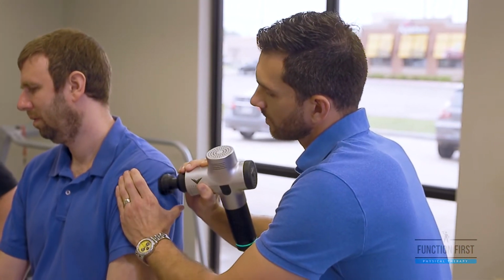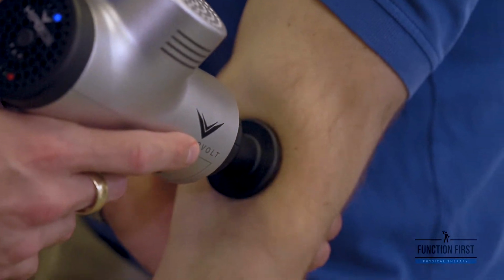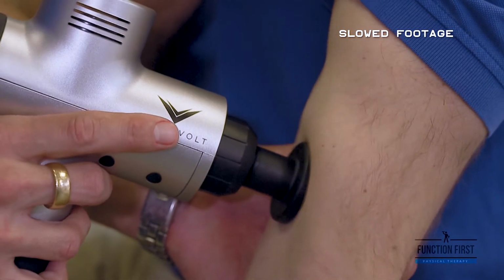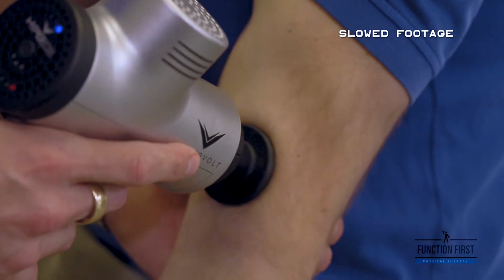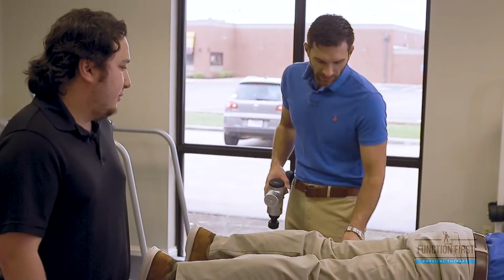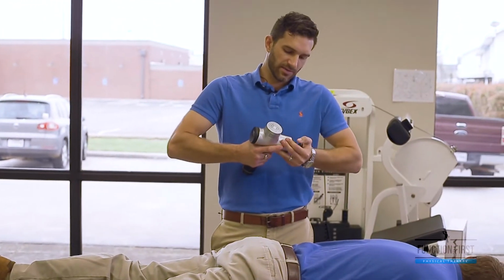For patients without the sensitivity issues, you can go directly over the skin, but you can also still go over clothing as well. And it's just going to give a more direct feedback and a deeper push with the percussion head.